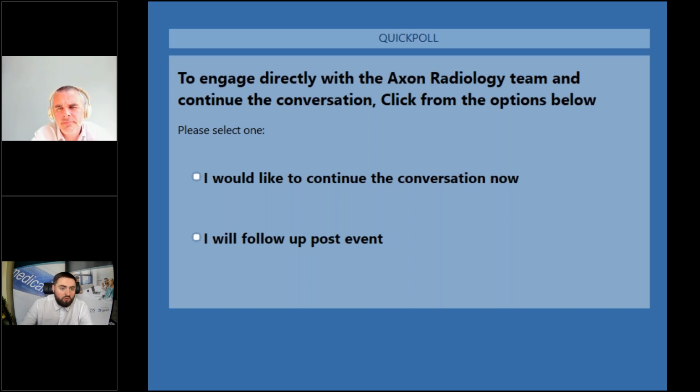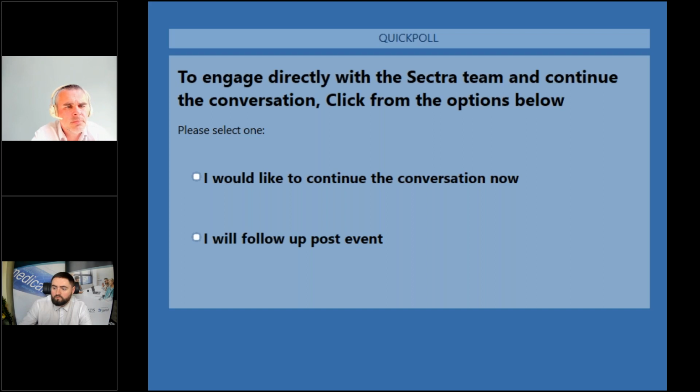Yeah, we'll link you up post-event as well. So coming from Doug as well: if deploying a home reporting solution using your Mitis platform, what information about the patient would the radiologist not have access to? Would it include the full EHR/RIS record as well as all imaging priors? Yeah, so with this VDI solution, basically they have access to absolutely everything. For both of these solutions, you have an exact in-hospital experience. You're essentially just accessing your desktop on your hospital computer, so you're streaming everything that you can see from that desktop.